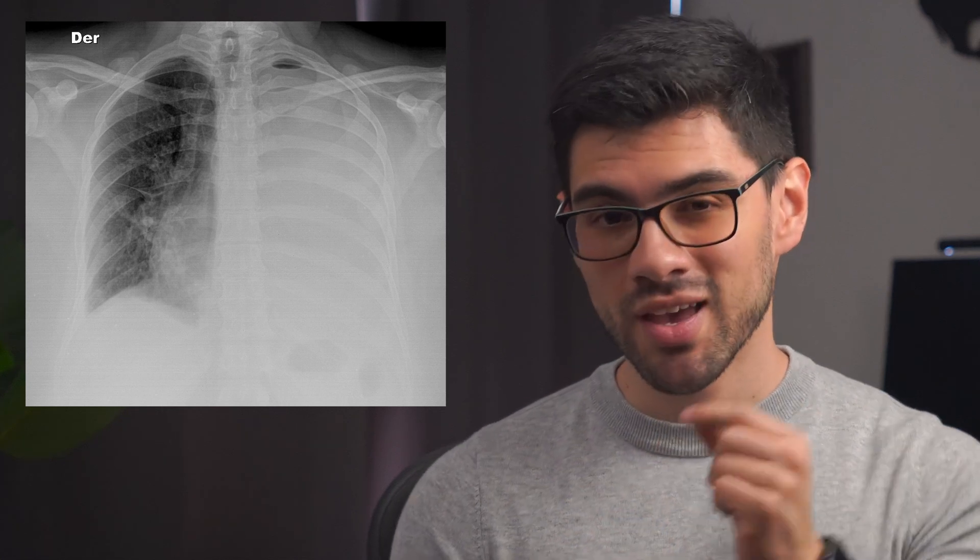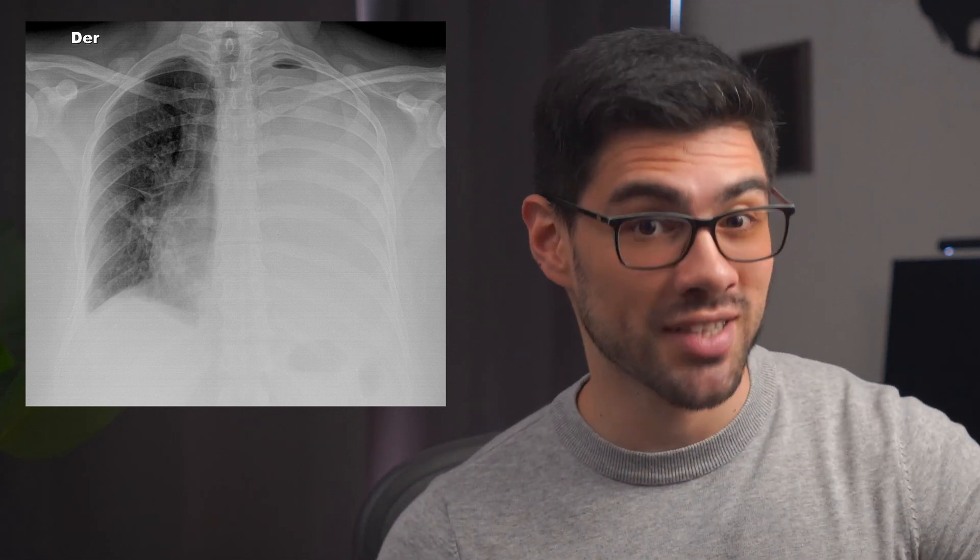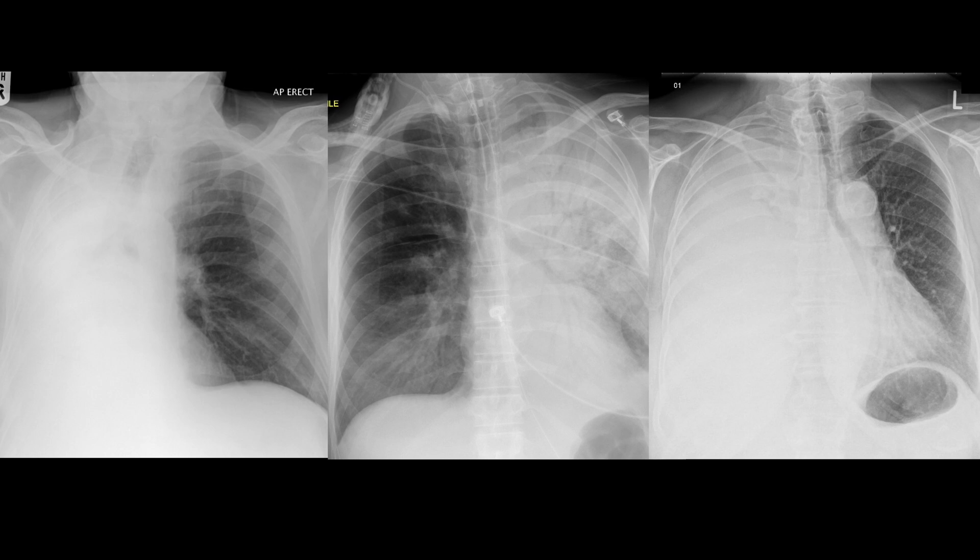One of the most important images a doctor needs to approach effectively is a chest X-ray with a one-sided white lung. How confident are you when approaching these kinds of images? Take a look at these three examples — are you able to list a differential diagnosis for each one? If not, don't worry. Most of the time it's actually quite simple. All you need to do is remember the three main causes and then look for key findings that help tell them apart, which is precisely what you'll learn in this video.